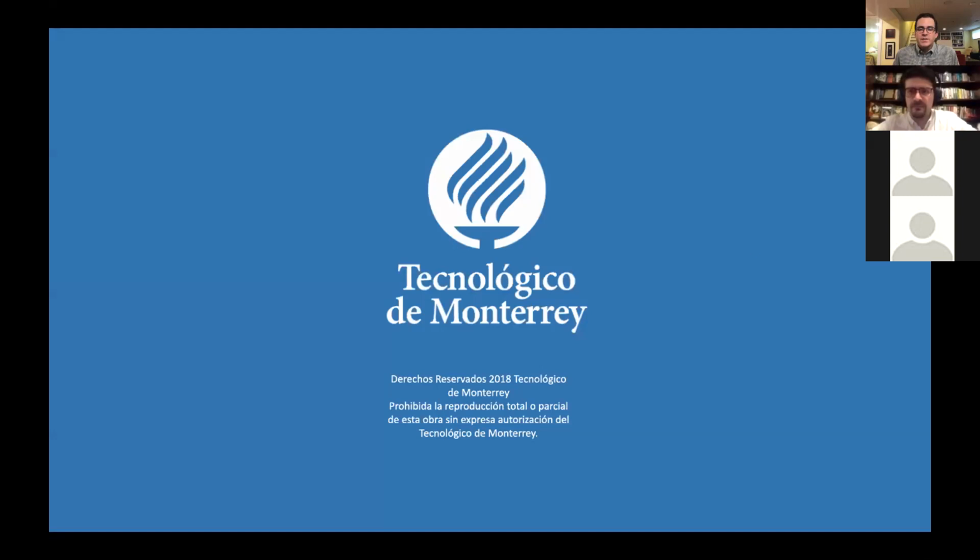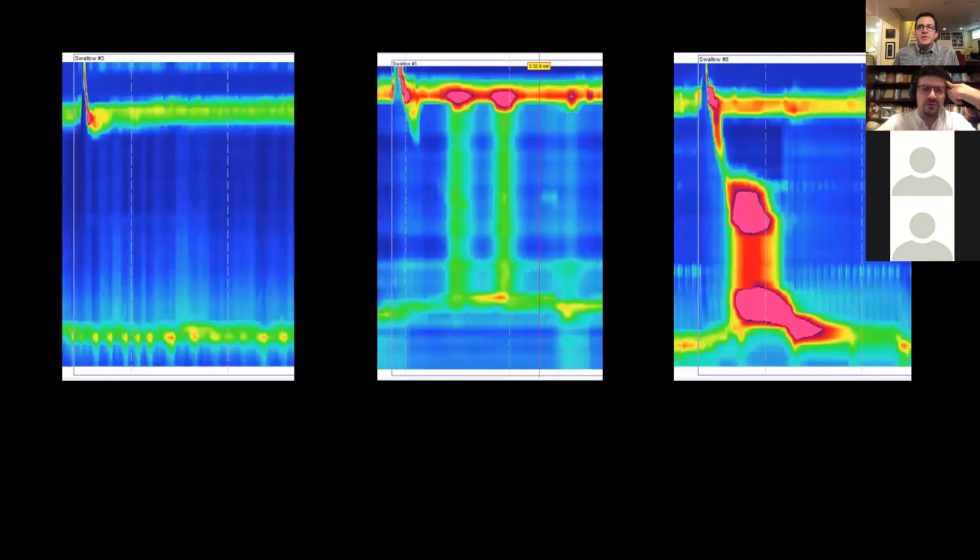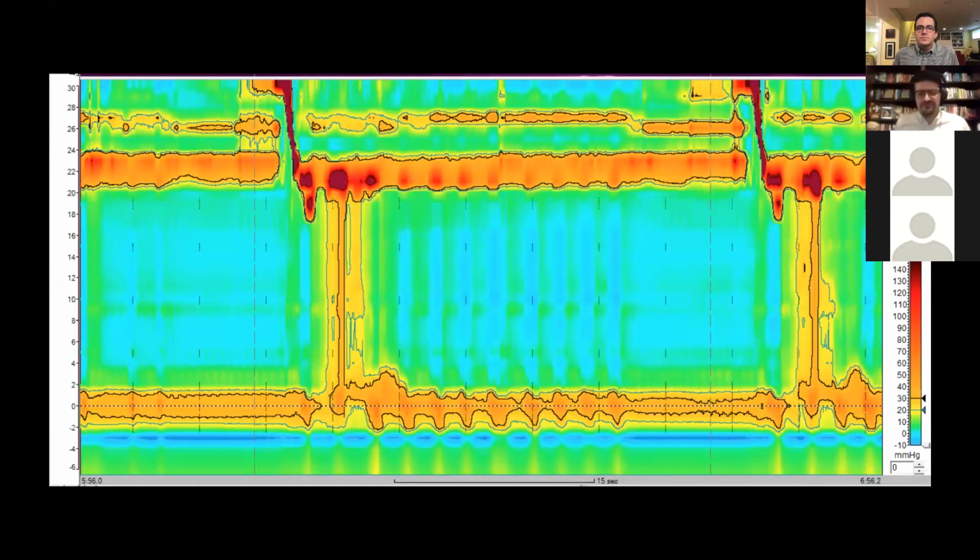That was fantastic, Alex. A number of folks in the comments are talking about pseudo-achalasia. Any pointers on looking at a manometry, how you can tell true achalasia from pseudo-achalasia? Or do you just have to go based on the clinical picture? I think a clinical picture is very important. You can't miss it if you have, for example, rapid weight loss, any other concerning features that should prompt you to get a CT or an endoscopic ultrasound.